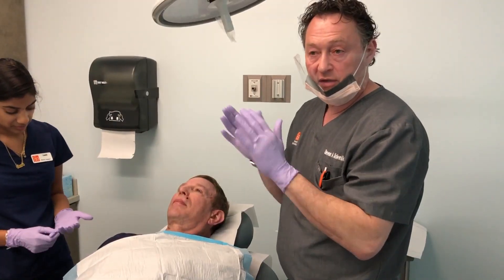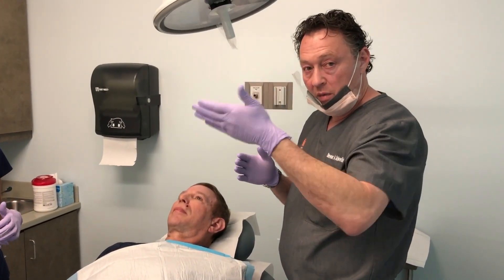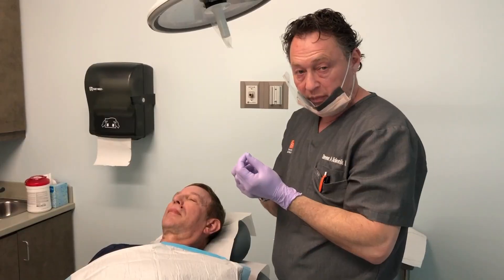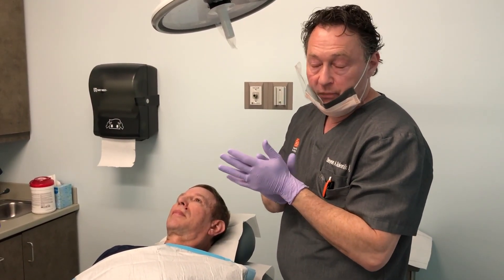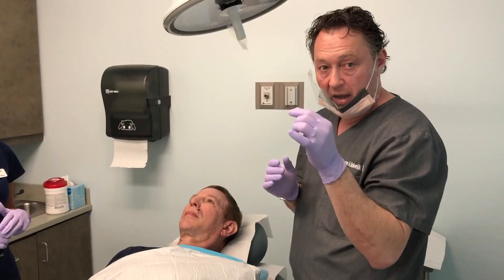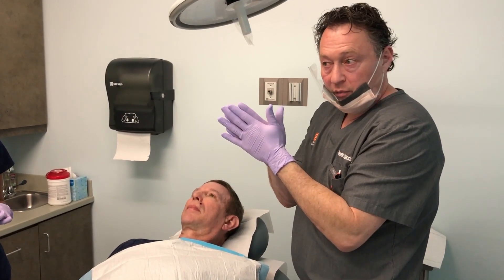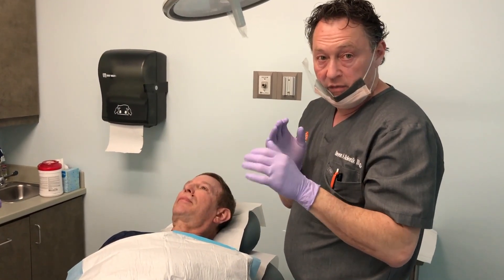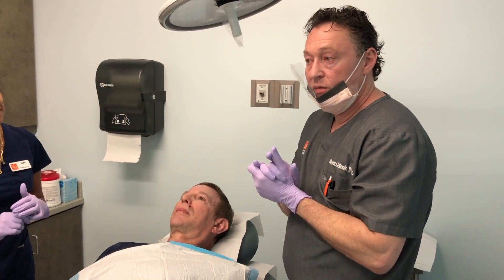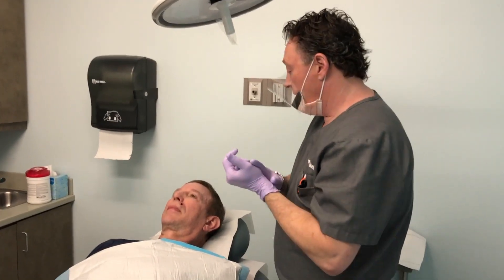Dr. Pinto is clear. As you saw in the lab, we looked at his slides — everything's great. So now we need to repair the defect that we created. We cut sort of a circular hole, and when we do Mohs we bevel the tissue — meaning we cut with an angle to the epidermis around the edge, which allows us to examine the epidermis more completely. But that's not what you want a defect to look like when you close it. So what we do now is reshape the defect — we'll make it more elliptical so it can close as a nice straight flat line. We'll de-bevel it, meaning we'll make the walls of the defect completely vertical so the stitches can go in and bring the two edges together more completely.